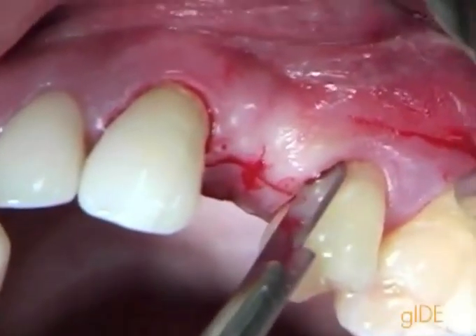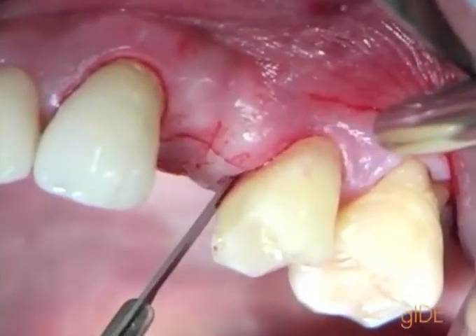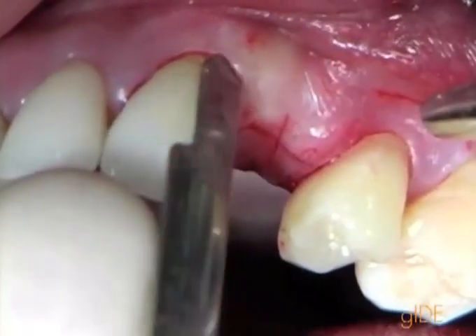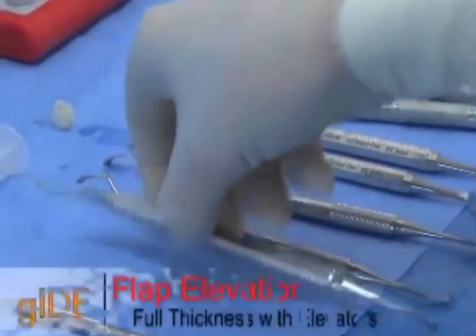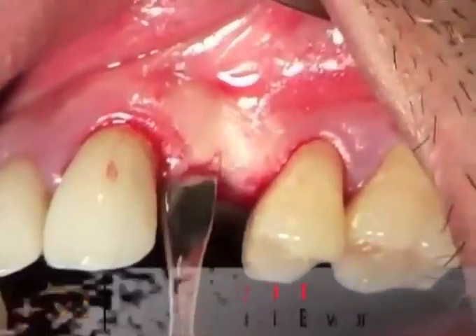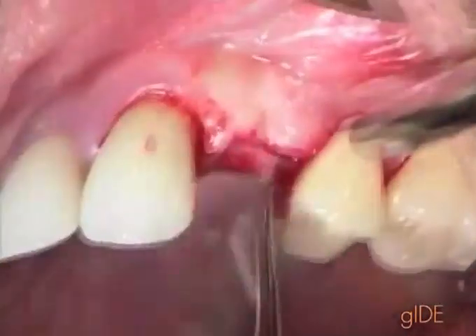The first incision is applied using a number 15 blade going through the crest, then going through the buccal sulcular, through the palatal sulcular, and the other adjacent tooth going through the buccal sulcular and the palatal sulcular. Very precise and careful incisions are made. Then elevators are utilized to make a full thickness flap elevation, which will show the underlying crestal bone.